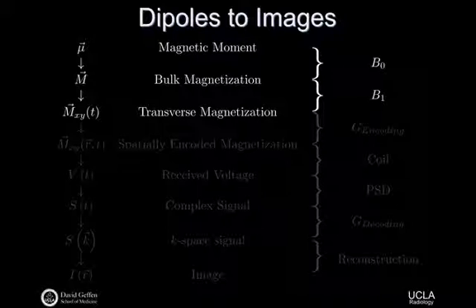And again, why was it so important to generate transverse magnetization? What's that? It's the most detectable. That's exactly right. The way these systems are put together, designed, set up, we are sensitive to detecting Mxy. We're basically, this comes much later in the class, insensitive to detecting changes in Mz. Now, that's a confusing statement if you know a little, but maybe not a lot about MR. So let's just leave it at the idea that the transverse magnetization is what we detect.